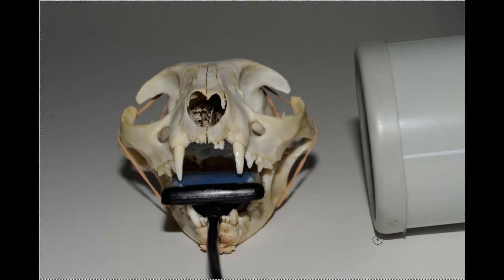Because we're going to start off with the cheek teeth, the teeth that are on the side, predominantly molars and premolars and perhaps part of this canine, our point of view is from the front. In order to see the angles of the side teeth, we need to look straight up the nose of the animal. So I've put the camera directly in front of the skull to enable us to see the angles of the side teeth.